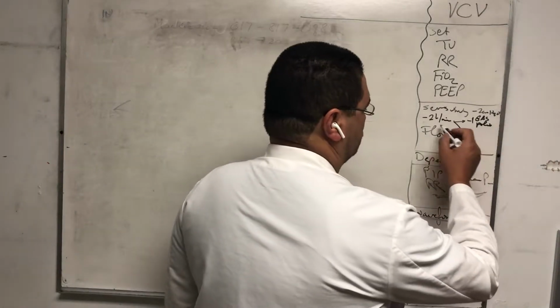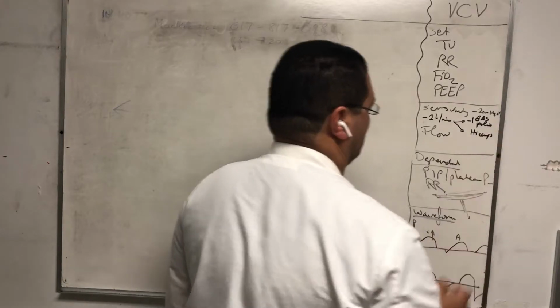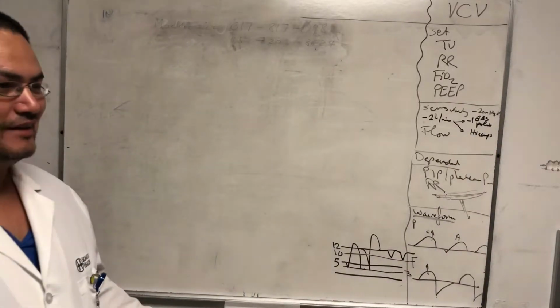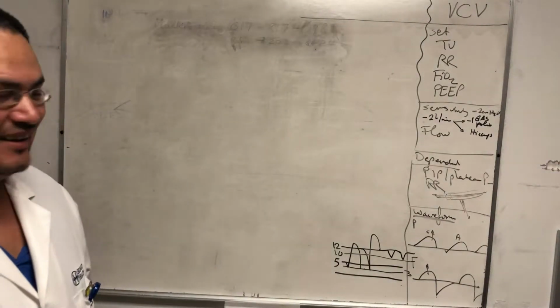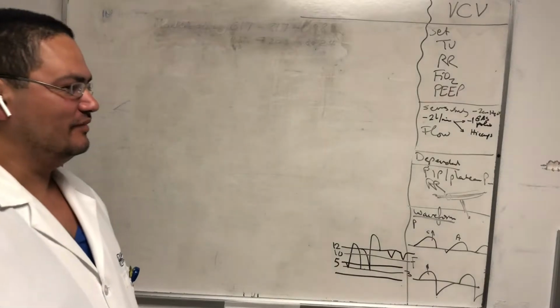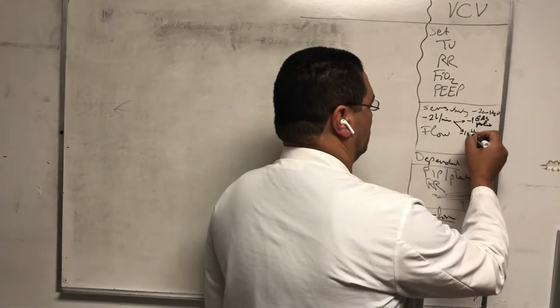It can also be too little for patients with hiccups. Patients with intractable hiccups, for example, can get like 80 breaths per minute and then seize. So we don't want that, so we can go up to -10 or -20.